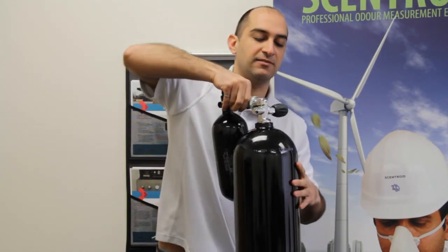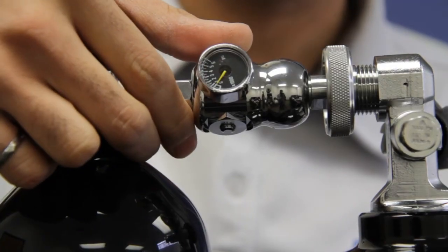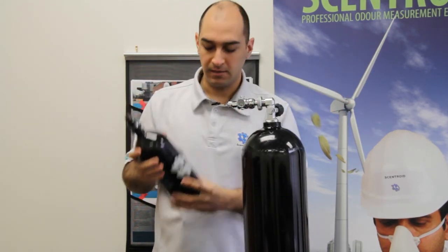You close it up, then push this button in the middle which vents the air out, and take out your tank. It's that simple.